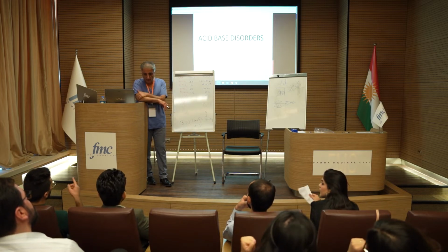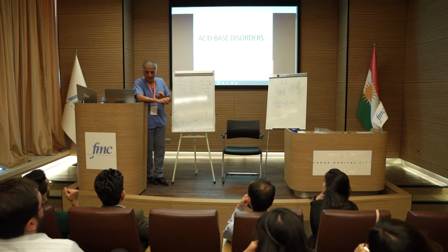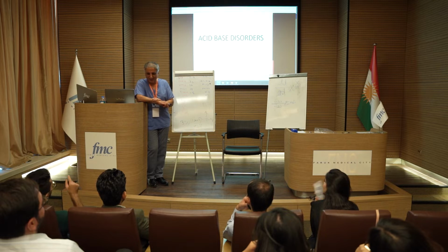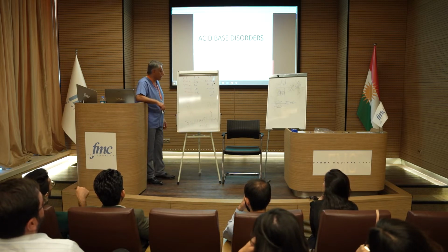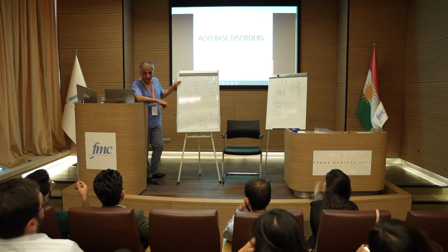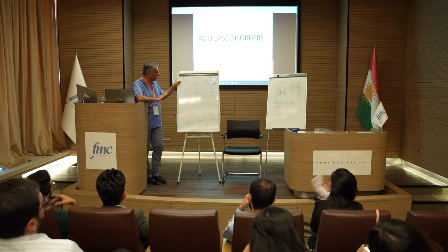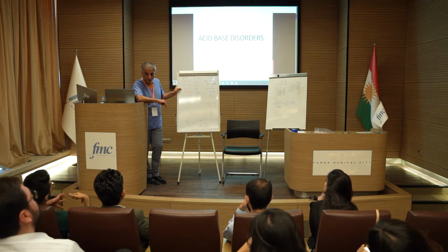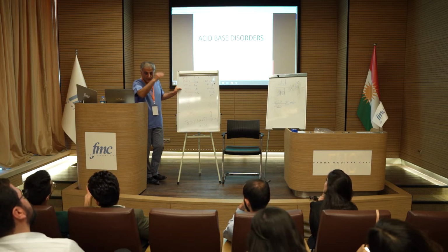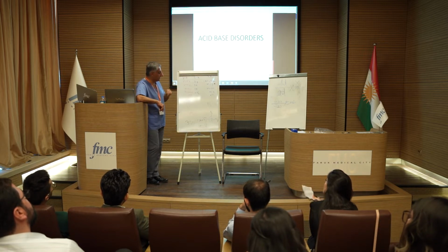So looking at this blood gas, first of all, we have a low pH, so this is acidosis, acidemia. Next, we look at the elements. The PCO2 is low, 3.3, so it can't be respiratory. We agree on that. And we look at the bicarb. It's also low, which means the base is low. So it's metabolic acidosis, of metabolic origin. And the base is -8.